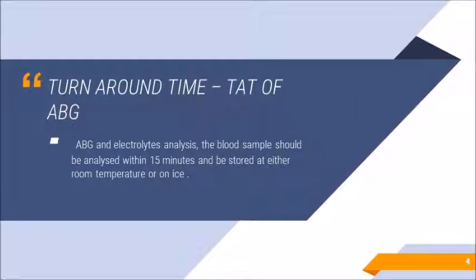While purchasing a blood gas analyzer, certain parameters and conditions are really important. One of them is turnaround time. For any other blood analysis, the time of testing and the time of drawing blood might not be of very large importance.